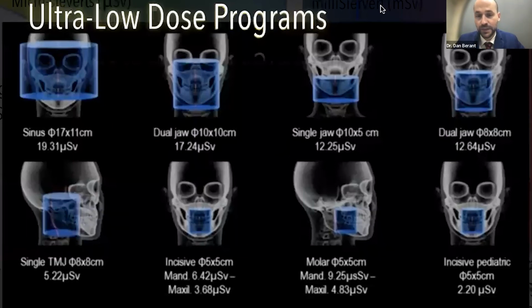And I mean, that's another interesting thing to briefly mention, because I know there is some work being done at University of Pennsylvania. Our standards for cephalometric values are based on a 2D Ceph. We're trying to expand that and understand growth and development as well, how this happens in 3 dimensions and different values aside from the 2D norms that we're looking at.